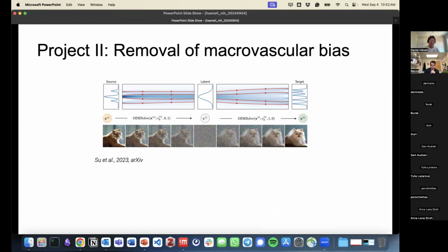We formulate an image translation task where we want to translate our microvascular-weighted spin echo EPTI data to gradient echo BOLD data using such a network. We want to use EPTI because it has several advantages.